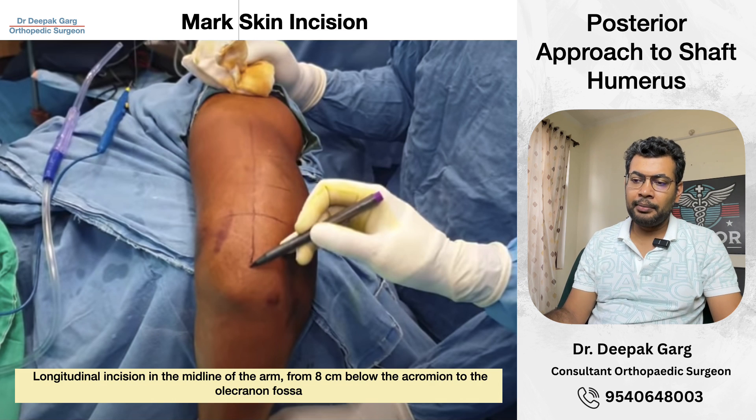After painting and draping, we will mark our skin incision. We will mark the olecranon — the tip of the olecranon — and the center of the arm on the posterior aspect. We will take a vertical incision mark: a longitudinal incision in the midline of the arm from 8 cm below the acromion to the olecranon fossa. This is our skin incision.